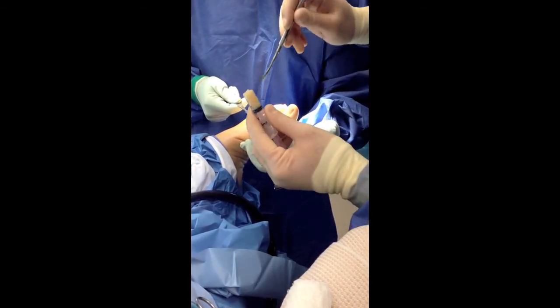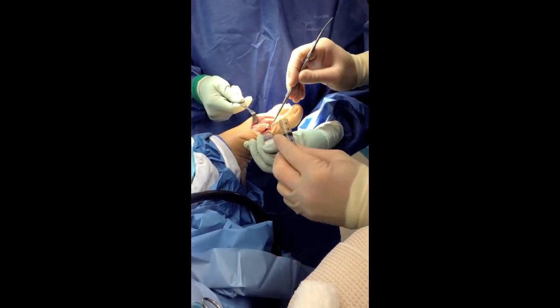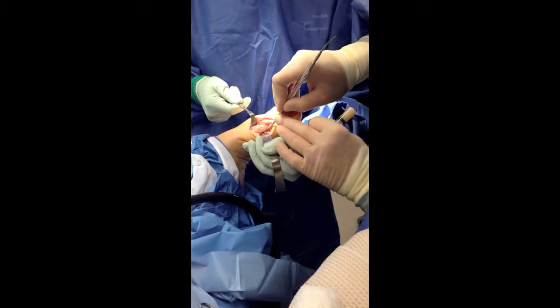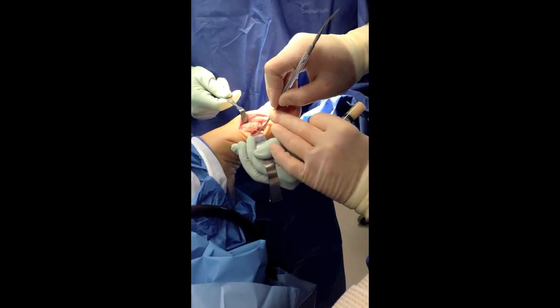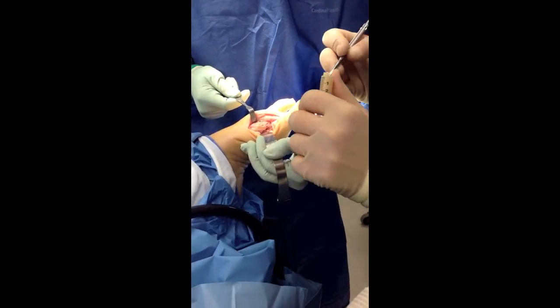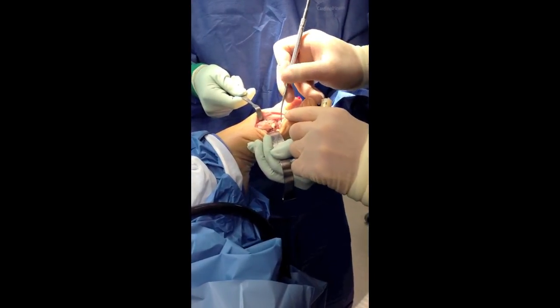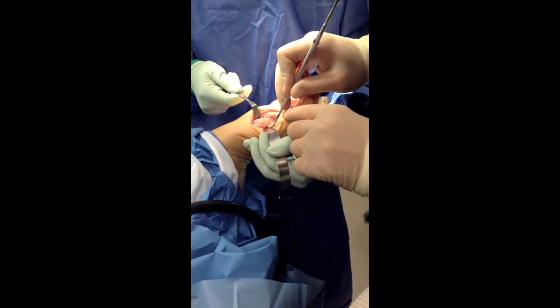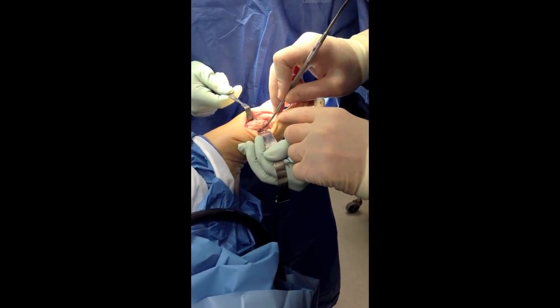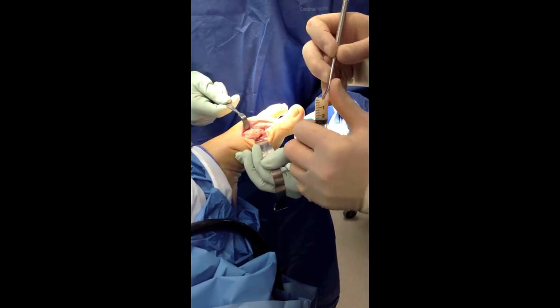So I'm going to fill up this void with this putty. As you can see, it comes in a nice hard mix, bone yet malleable enough to stuff right in that gap. One scoop, two scoops. You can see the bone matrix is most of the composite, unlike the gels that go away.